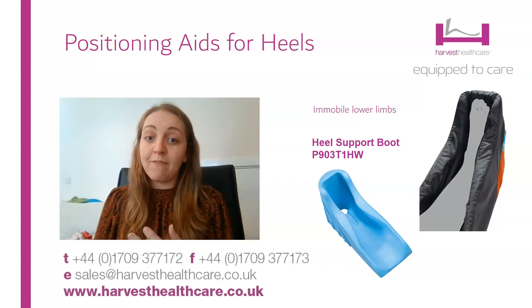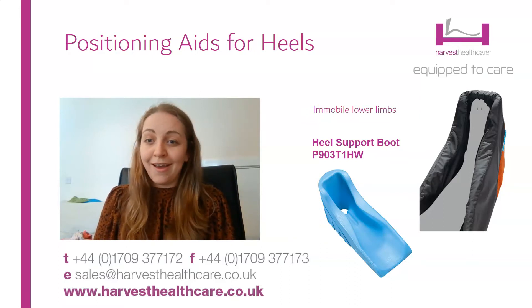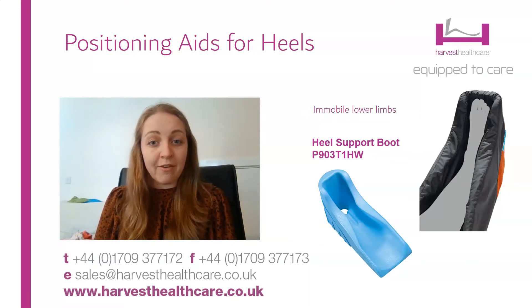A lovely product — really comfortable, very lightweight — and so not as intrusive as you might think, and a really nice thing to add for the care of those people.